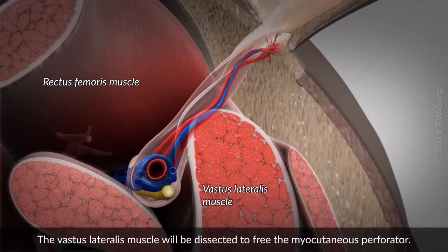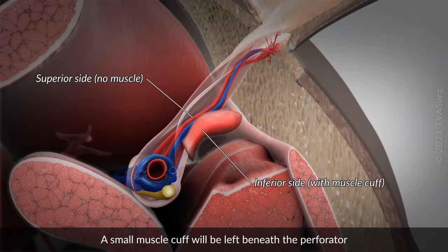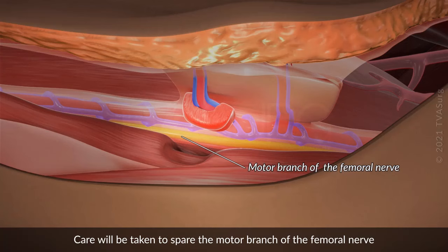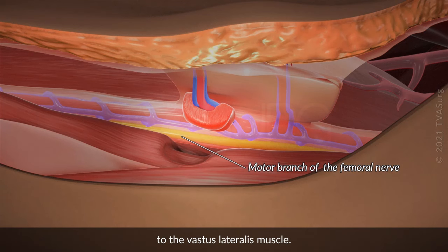The vastus lateralis muscle will be dissected to free the myocutaneous perforator. A small muscle cuff will be left beneath the perforator, to identify the orientation and prevent twisting and injury to the perforator. Care will be taken to spare the motor branch of the femoral nerve to the vastus lateralis muscle.